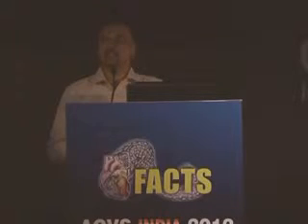However, the problem with the Amplatz catheter is that it is definitely a little more technically demanding, and one has to be familiar with this catheter before one embarks on doing this on a regular basis. The second thing is that there is certainly a higher risk of dissection, especially in the right coronary artery. It is a very small but finite risk, so one has to be familiar, be very careful, and keep this in mind.